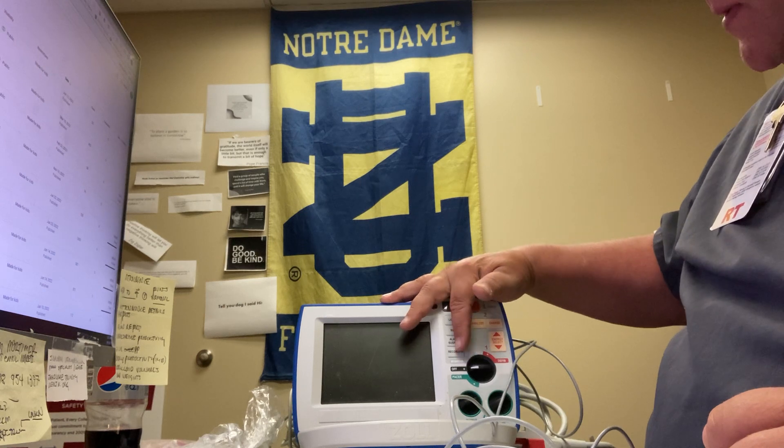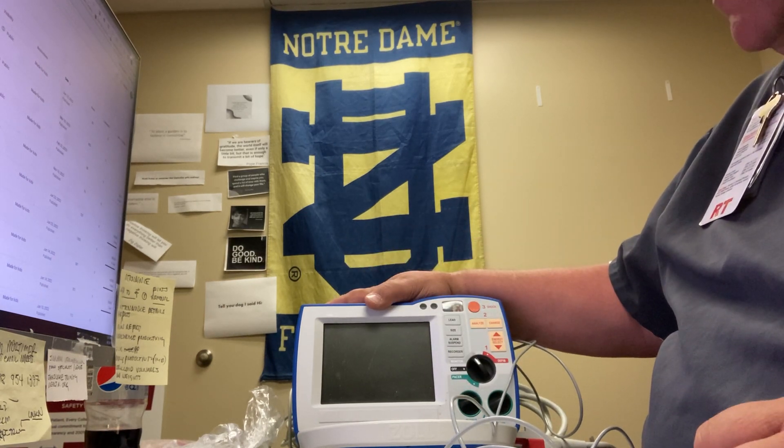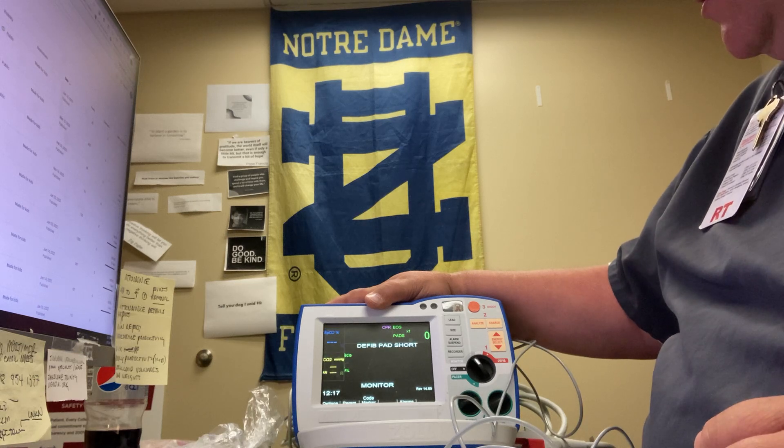On the monitor itself, it's in the off position. You're going to turn the monitor on. The screen will come on, it'll do a couple of beeps, letting you know it's being turned on.